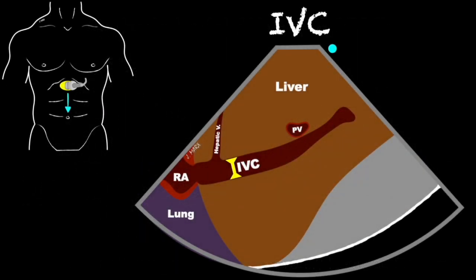Finally, so we have an idea of what the function of the heart is, and then we can consider what is the volume status, or what's the central venous pressure. For the longest time, we thought CVP correlated with fluid responsiveness, and it doesn't. It does tell us the pressure of the right heart, which can be up for multiple reasons. That can be fluid overload. It can be right heart failure.